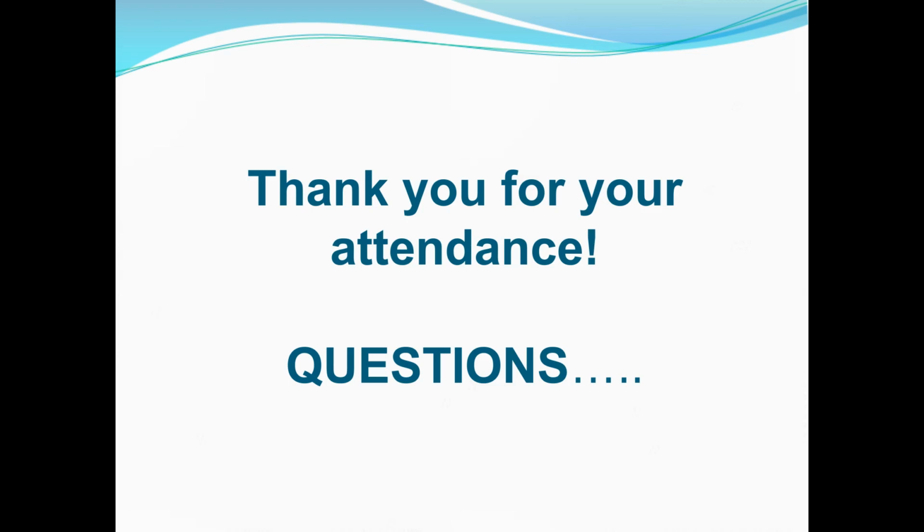All right, next question. What percentage of samples need extraction? That I don't know off the top of my head. If I had to guess, maybe 20%. For our laboratory and our technologists, it's really not a high number. All right, thank you. Next question. What's the advantage of MALDI over target-specific amplification by PCR? So that just goes to looking at the cost savings, which was in my slide.